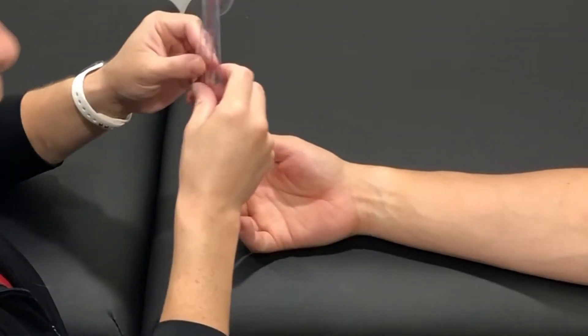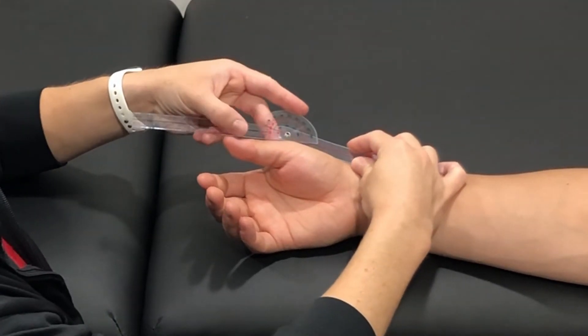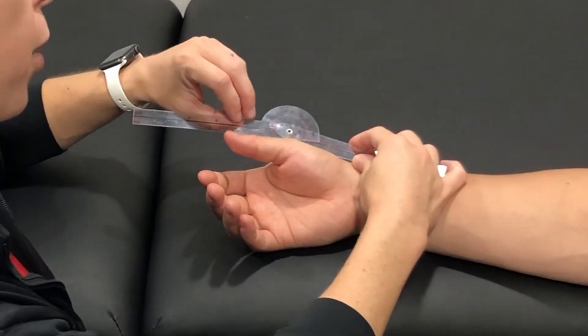Measuring active range of motion. I'm going to line my goniometer up with the dorsal MCP joint. I'm going to line my stationary arm up with the dorsal line of the metacarpal, and my moving arm will line up with the dorsal midline of the proximal phalanx.